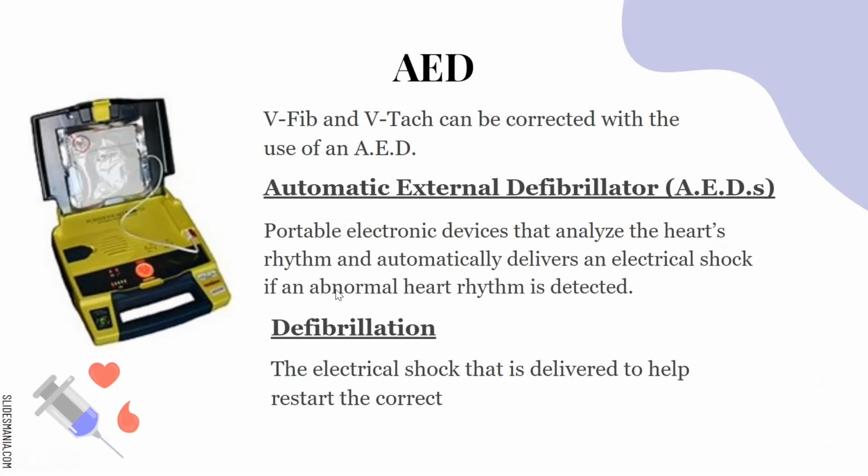VFib and VTAC can be corrected with the use of the AED. So it's an external electrical signal that pushes or jump starts the heart. So textbook definition: a portable electronic device that analyzes the heart's rhythm and automatically delivers an electrical shock if an abnormal rhythm is detected. Defibrillation is known as the electrical shock that is delivered to help restart the heart.